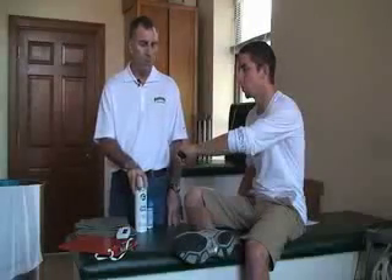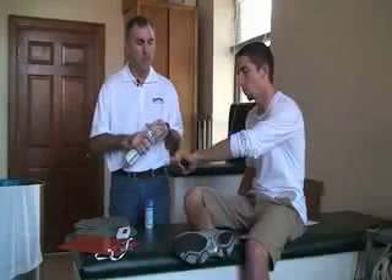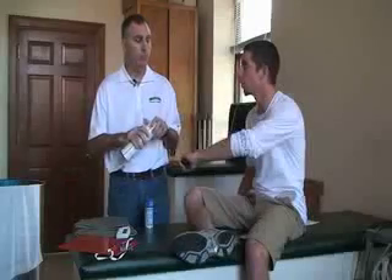Next we want to inform the patient that this is going to feel a little cold, but if he notices any pain or discomfort during or after the treatment, to please let you know.